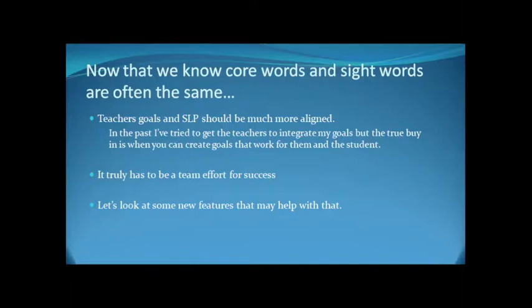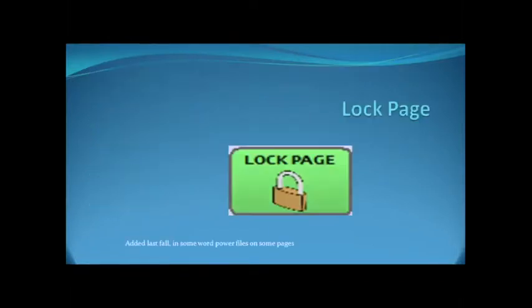But really, if you work together with them and you talk about core words and sight words together and you have the same goals and they're not so separate, it might help the team all focus on the same thing for success, because using the device with core words and getting the students to read and write is all going to work together.